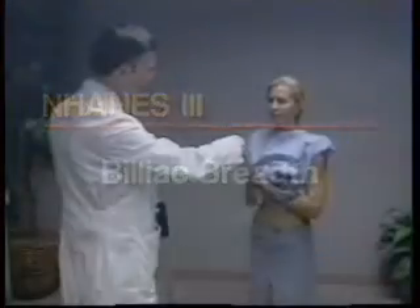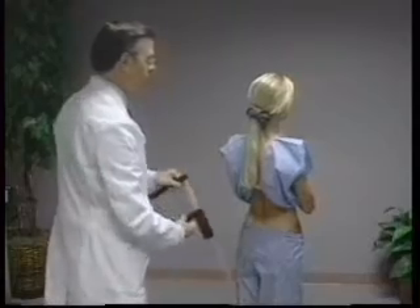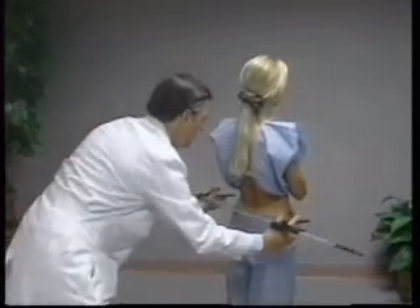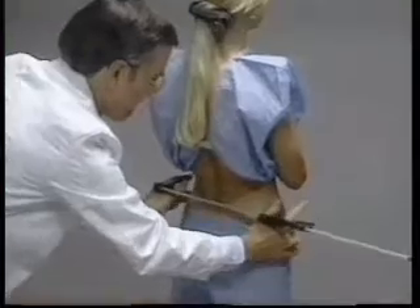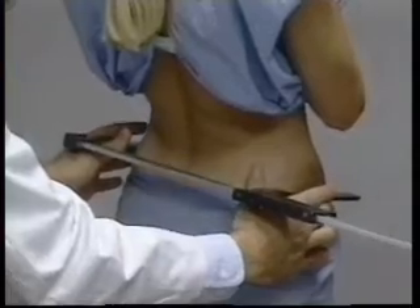Bi-iliac breadth is taken while the subject is standing upright with the feet together and the waist area exposed. The technician stands behind the subject, resting the large sliding caliper between the thumb and index finger of each hand. Using the middle fingers, the uppermost lateral borders of each ilium on the mid-axillary line are located on both sides of the body.